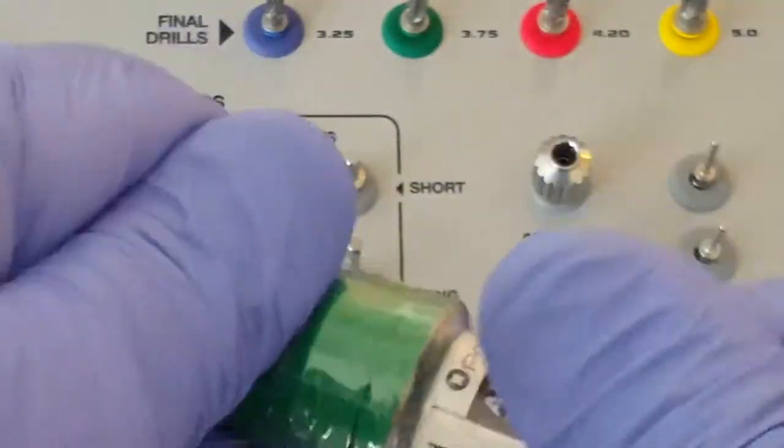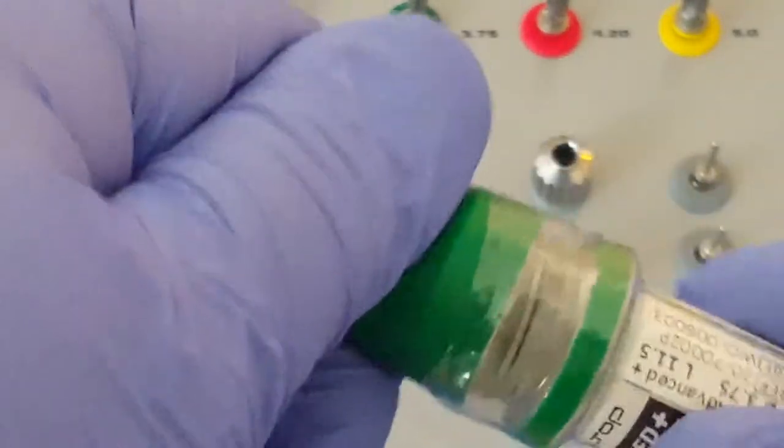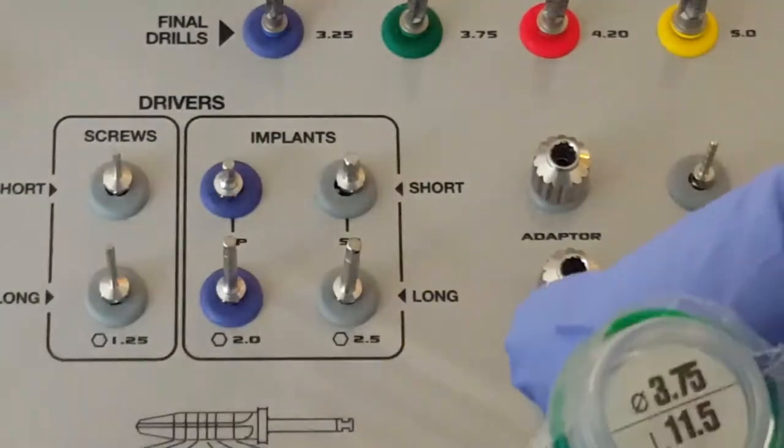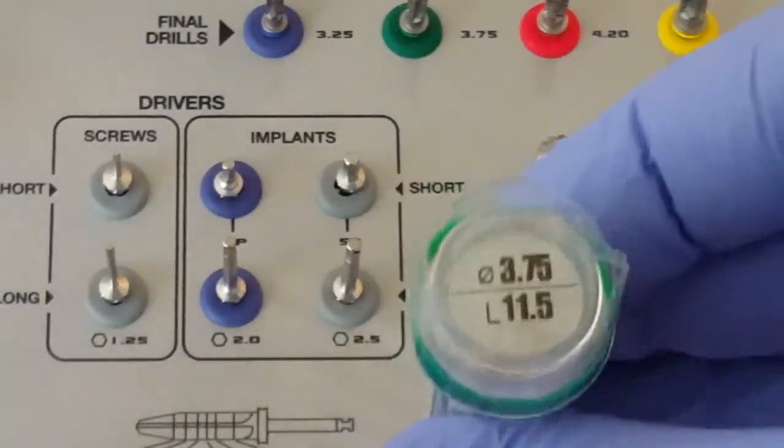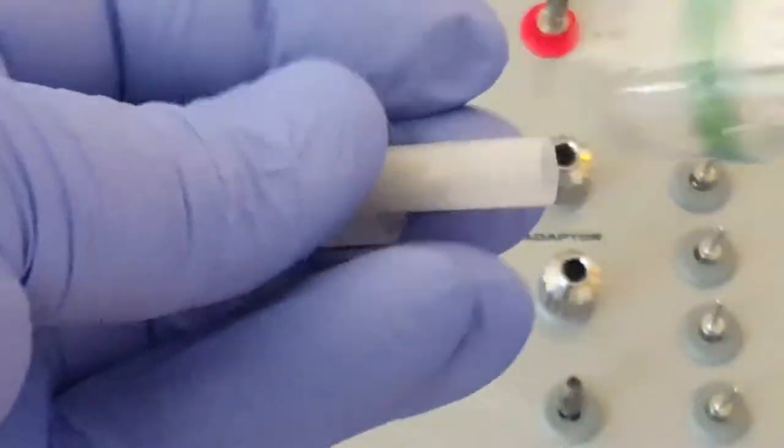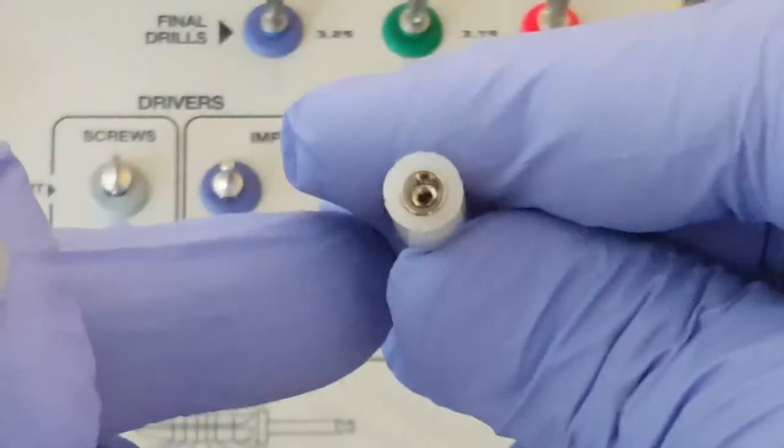We open the vial by twisting, easily done by the doctor or the assistant. There's a second vial also labeled inside. We take the implant out. Inside it is encased in titanium.